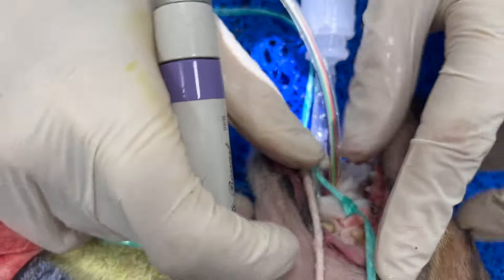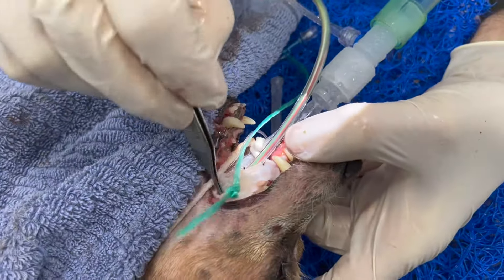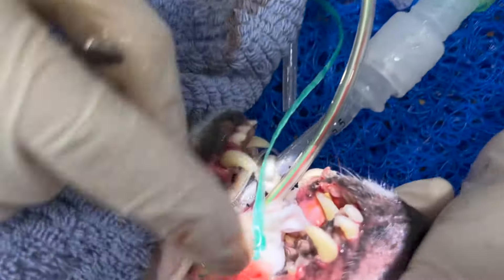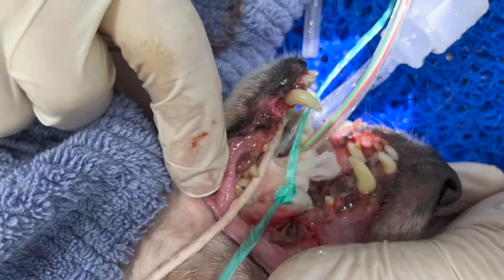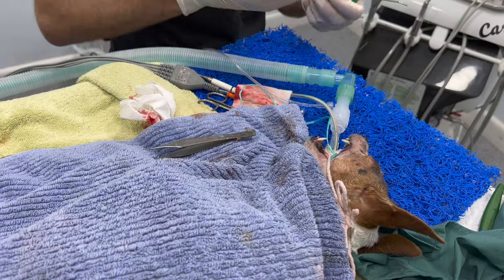If you compare it to what we had at the beginning, this side is actually looking pretty nice. We're going to start polishing now — still a bit to go.